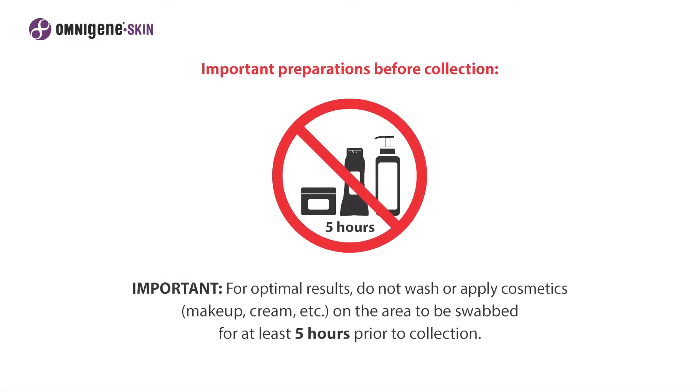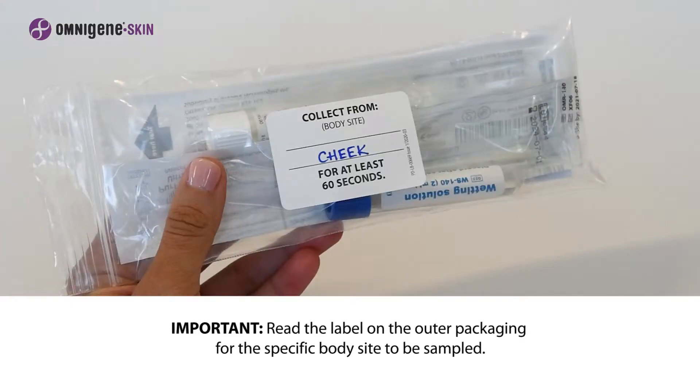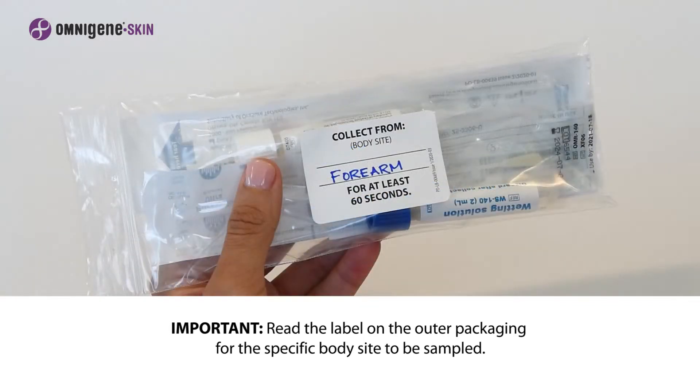Important preparations before collection: for optimal results, do not wash or apply cosmetics on the area to be swabbed for at least 5 hours prior to collection. Before beginning, read the label on the outer packaging for the specific body site to be sampled. Collect only from the skin location indicated on the outer packaging label.